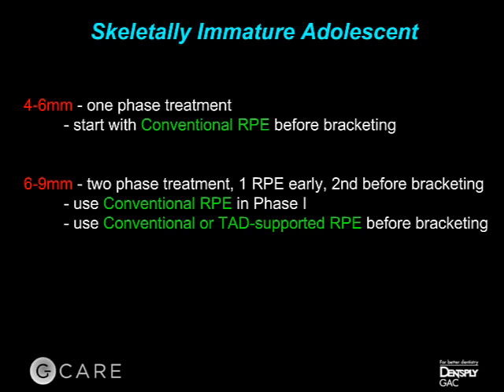This also goes to saying that if we use a lip bumper to now upright the teeth, which were lingually inclined prior to the first expander, and we do happen to gain bony change, we'll just remeasure, and if we need to, then we'll re-expand. So that's why I said it's not really clinically significant to me whether or not we can get a lip bumper to have bony change in the mandible, because I'm going to remeasure and re-expand as needed if that does happen.